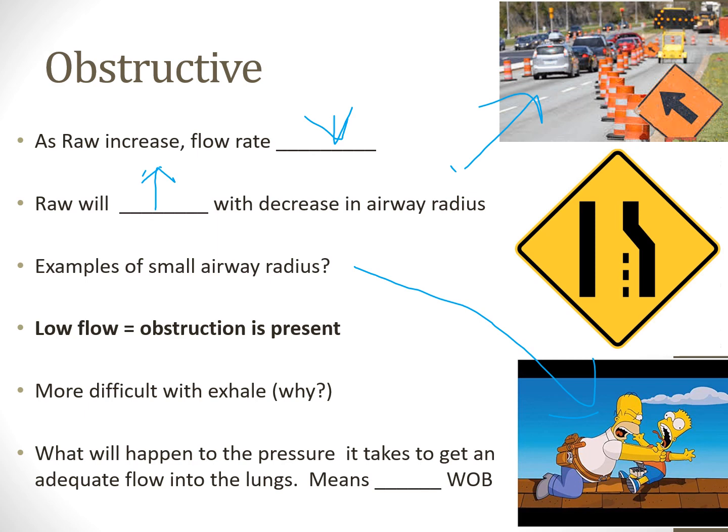So whenever you see low flow rates on a pulmonary function test, pay attention to this, because I know you zoned out somehow. Anytime you see low flow rates, that means you have an obstructive airway condition present. So any flow rates that we look at on a pulmonary function test, if the flow rates are low, that means there's an obstructive condition present.